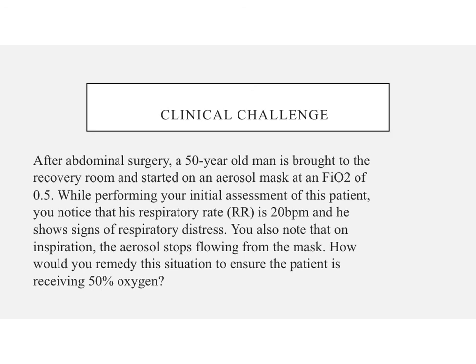So let's kind of dissect this. You know he's on 50%, and his respiratory rate is still technically within normal limits, but he's showing signs of respiratory distress. And then you also notice that aerosol stops flowing through the mask. So those are our red flags. From Therapeutics 1, you know that this is not meeting his demands. He's not getting enough from this. So he is entraining room air, which is going to decrease his FiO2.